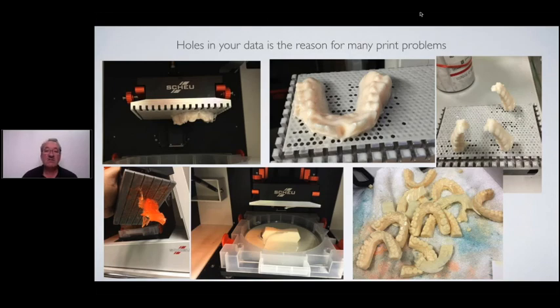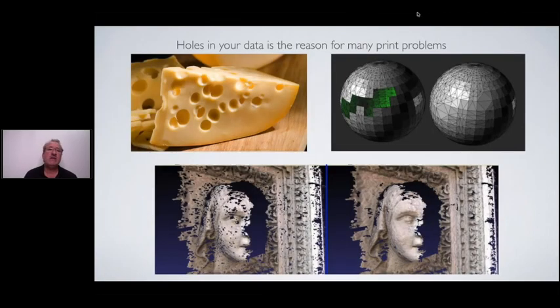None of the printers which I know in the dental field have good software. They all have a problem with their software, because most of the cases which we get are like Swiss cheese. The data has holes inside it. If you have holes in your data, you need something to fix those holes. Otherwise, you'll get misprints, okay?